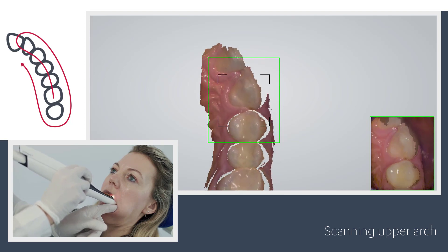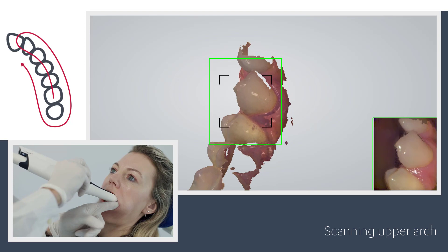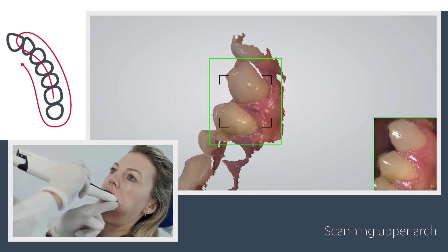When you reach the canine, turn slowly buccal by rotating the scanner 60 to 90 degrees, taking care first of the areas where soft tissue may interfere with the scan.